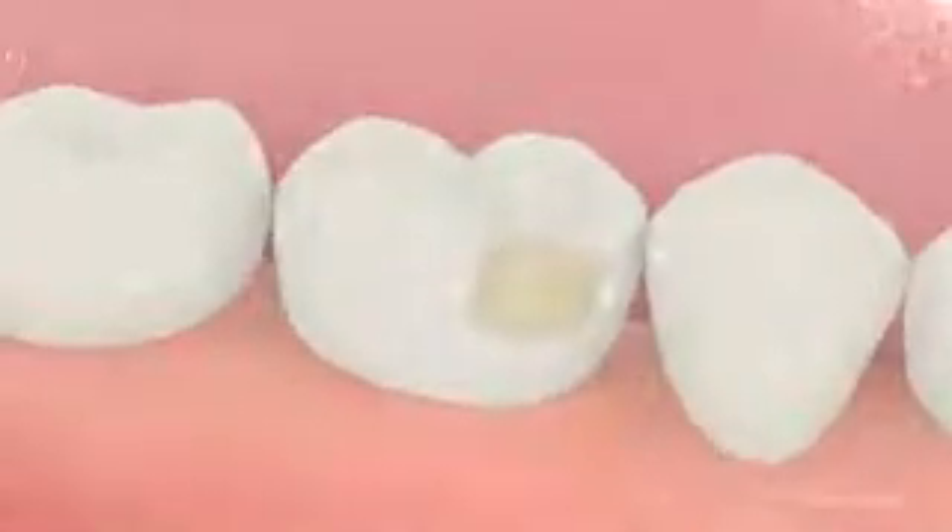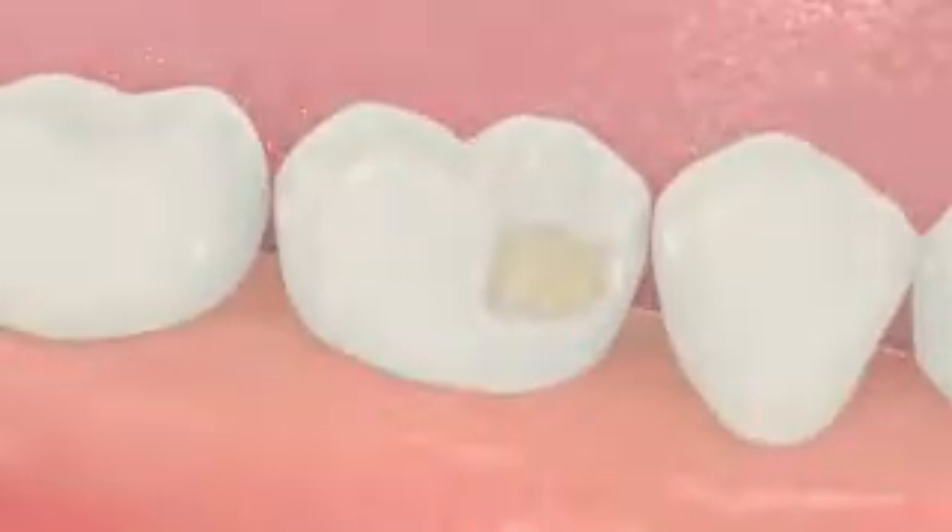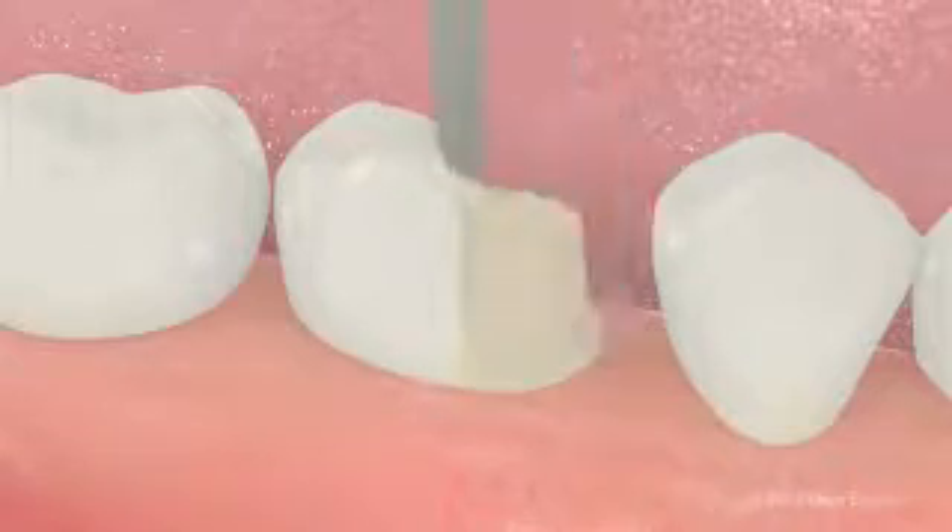So what are the steps involved in crowning a tooth? First, your dentist will numb the area to make you comfortable. Then your tooth will be shaped to fit inside its new covering.